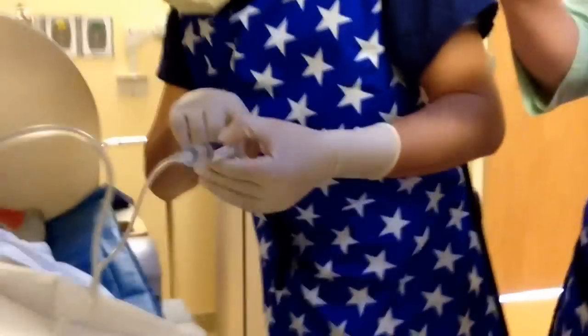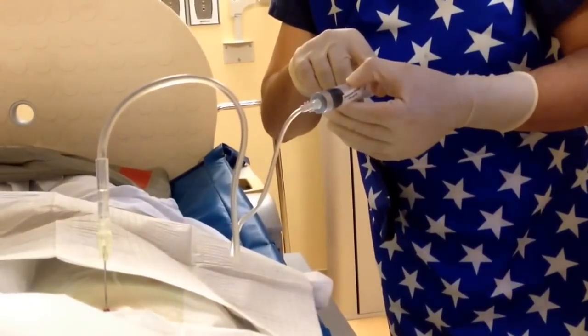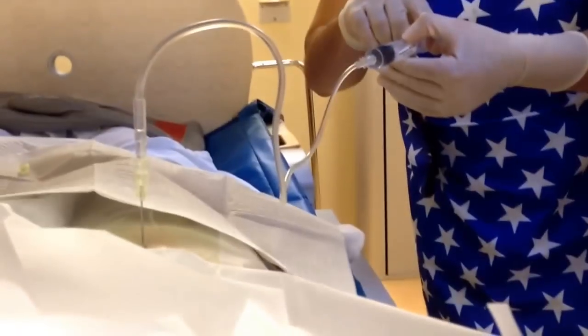There's the x-ray. Look at that. They like what they see — they're going for it. They're putting the stuff in. I do feel like I can feel my joint filling up, even though there's no pain of any kind. I feel comfy.